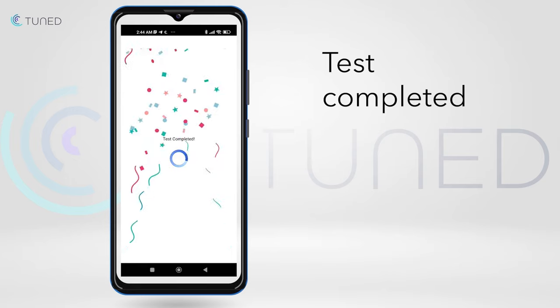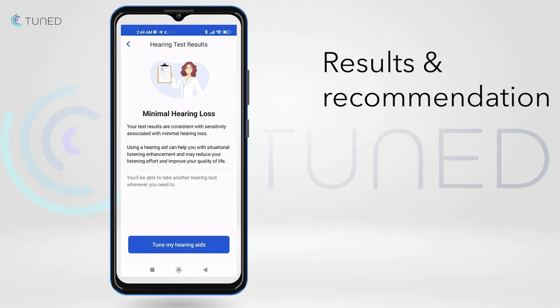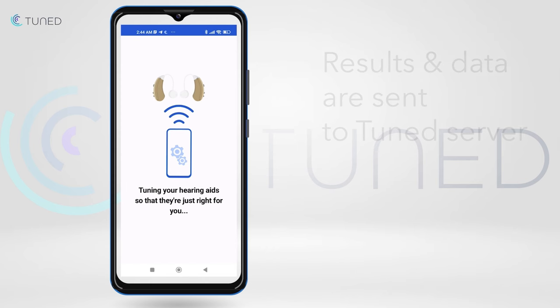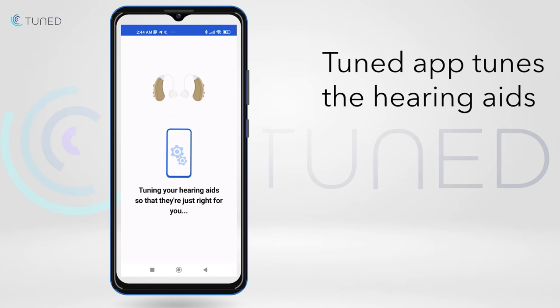When the test is completed, the user will get a short brief of the results and a recommendation to start using the hearing aids. Once the Tune My Hearing Aids button is pressed, the hearing test results and other data are sent to our server, where our unique algorithm tunes the hearing aids according to the specific user needs.